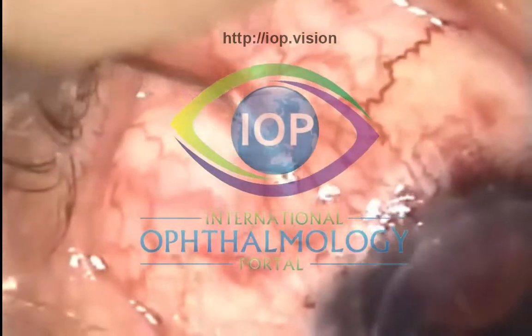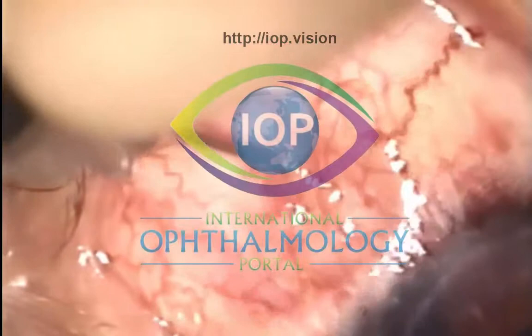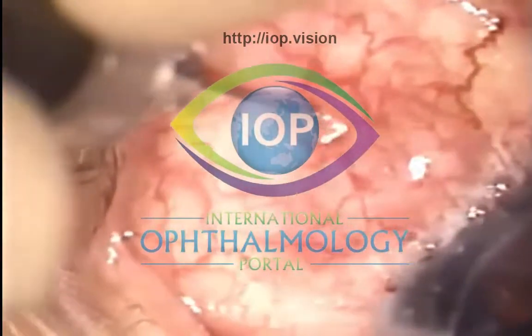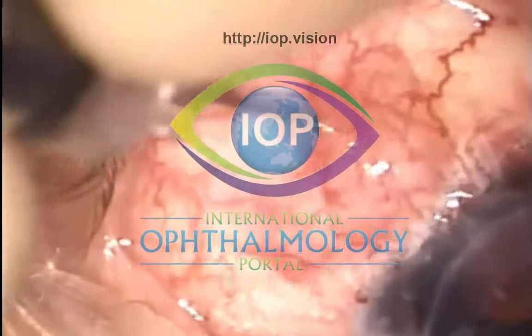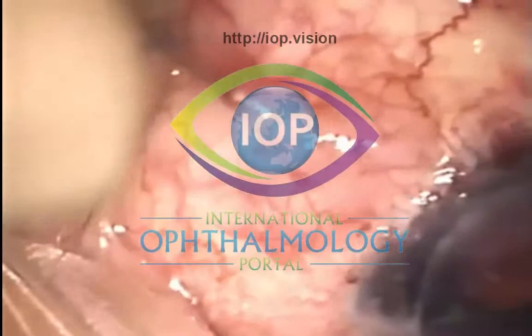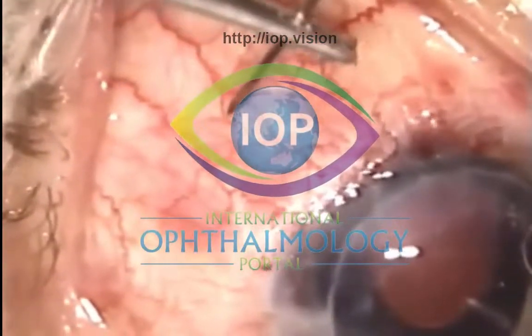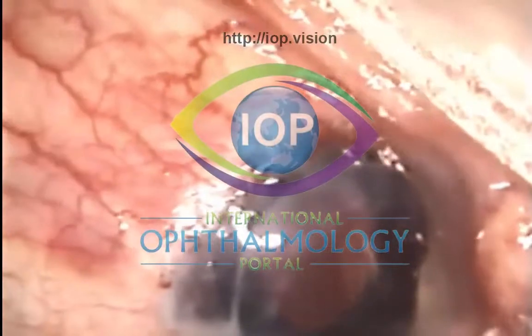I'll just show you a couple of extra little points, and I would emphasize at the outset that this is not my standard bleb needling technique. You'll see that it's rather an aggressive technique, because even before I start the tissues are extremely thickened, and yet I can see there is the potential for flow. I start off the case by applying viscoelastic to the eye, so that the graft is protected.